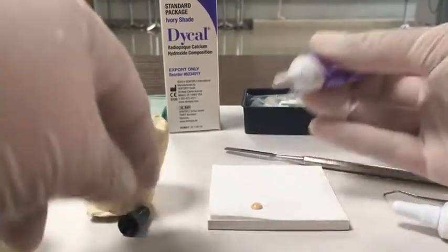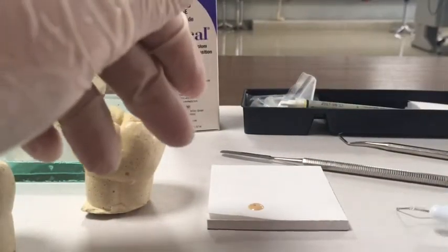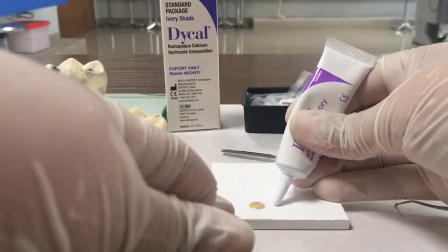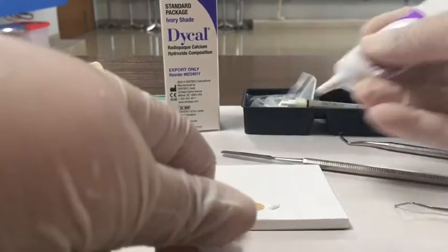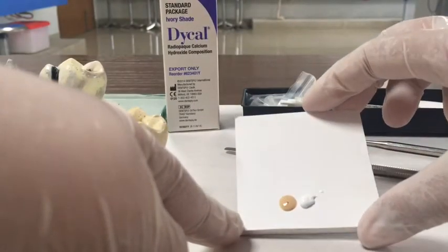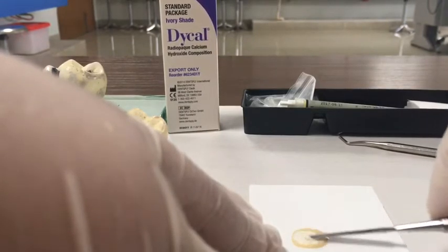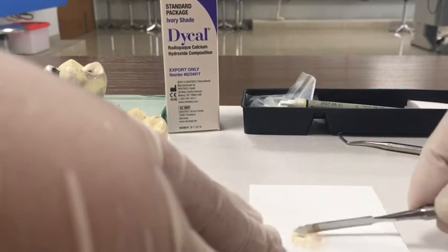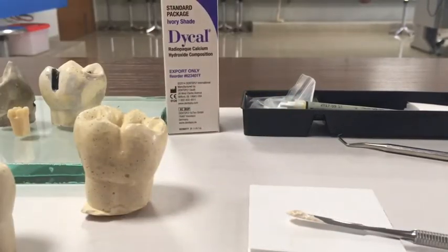Now we are going to take the base and the catalyst in equal quantities on the mixing pad and mix these two pastes nicely until a uniform color and consistency is obtained.